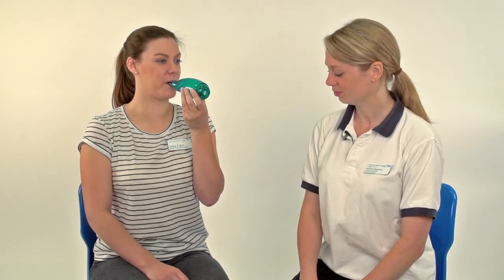That was really good — have another go. Breathe in and then breathe all the way out. Keep going and relax. We would normally get you to do the breaths in cycles. If you're just starting for the first time, we might dictate how many cycles you do based on how it feels whilst you're getting used to the Acapella. Ultimately we want to build up to ten breaths per cycle, and then repeat those cycles to clear out the lungs.